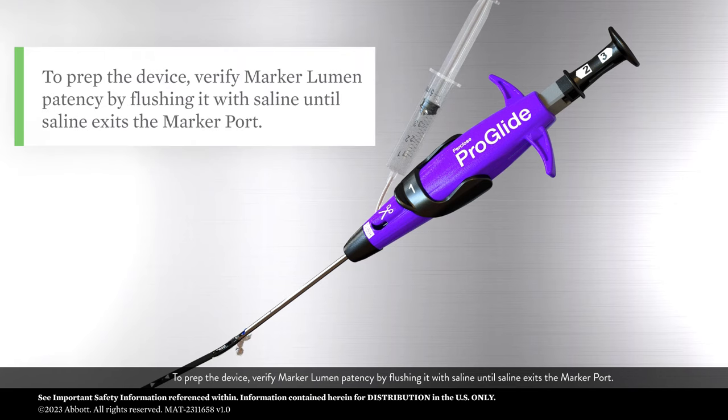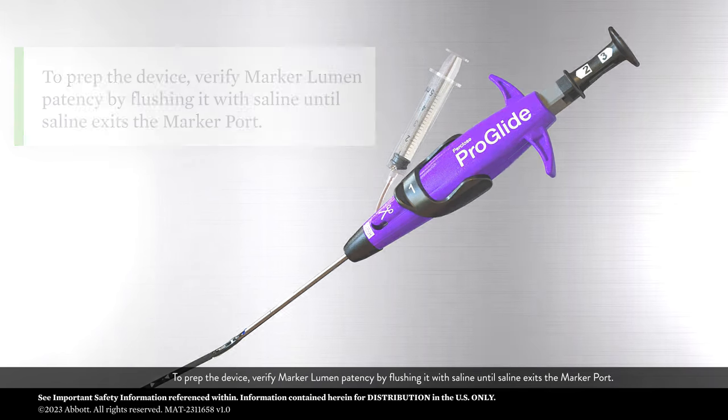To prep the device, verify marker lumen patency by flushing it with saline until saline exits the marker port.